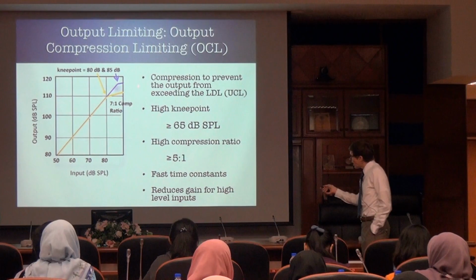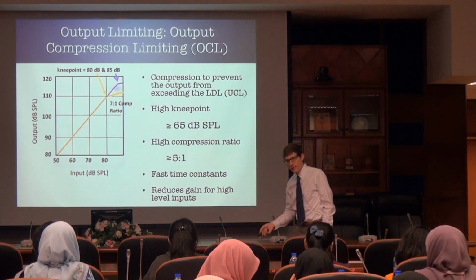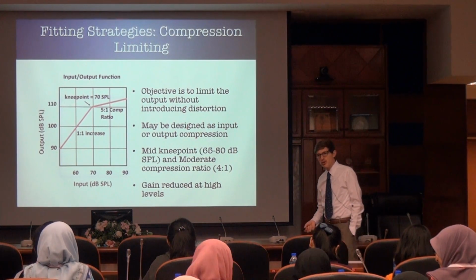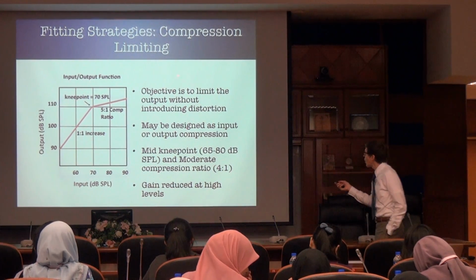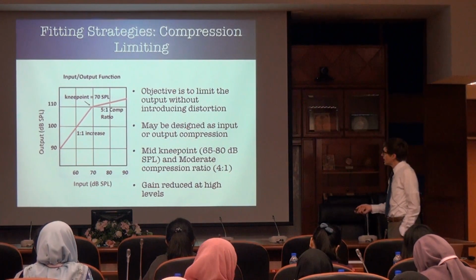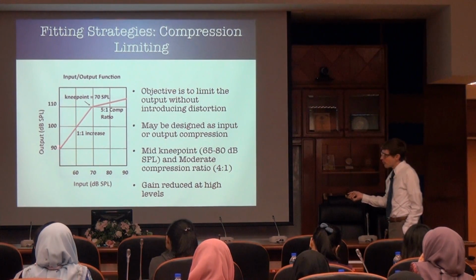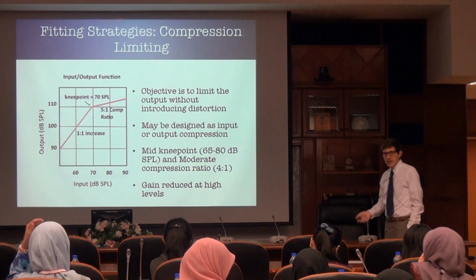Compression at high input levels is simply there to keep the patient comfortable and to avoid distortion. Now, we have two typical fitting strategies based on compression in hearing aids. This first one isn't used very often anymore, and it is called compression limiting. What compression limiting says is that we're going to keep the hearing aid linear for most input, and we only do compression above, say, 70 dB.